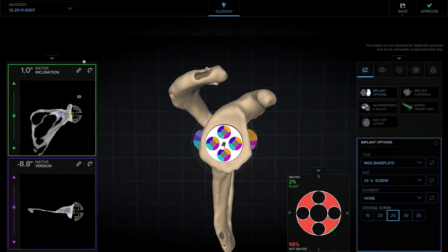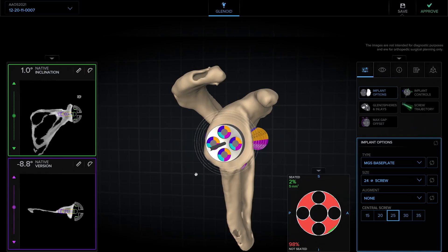First, I'd like to look at the patient's native inclination and native version. For this patient, they have one degree of inclination and eight degrees of native retroversion. That'll help me decide what implant I'm going to use.